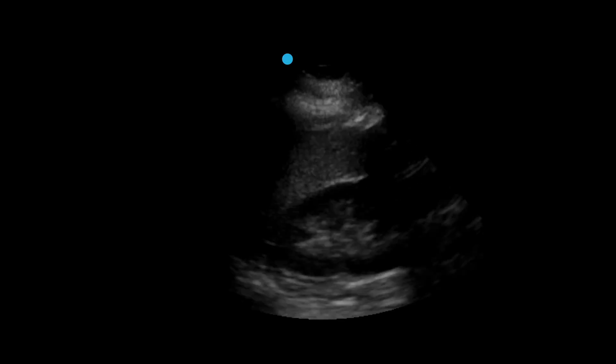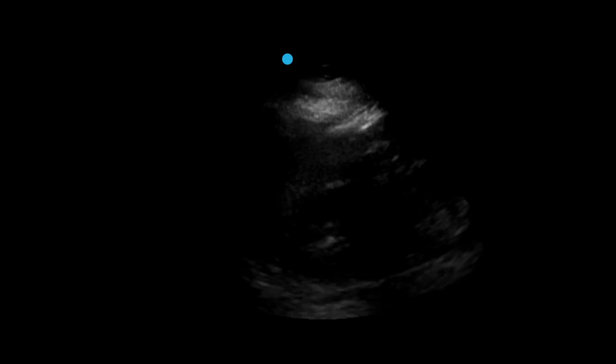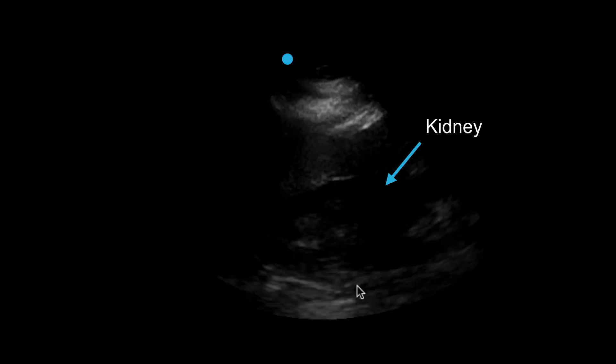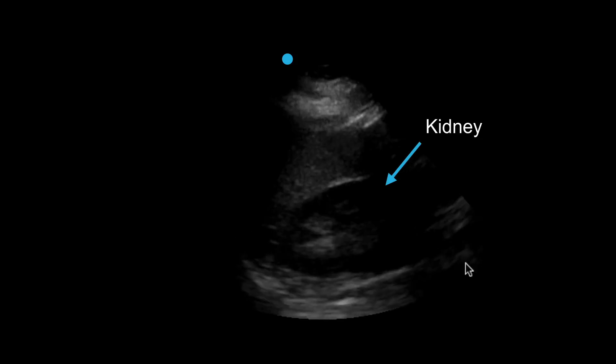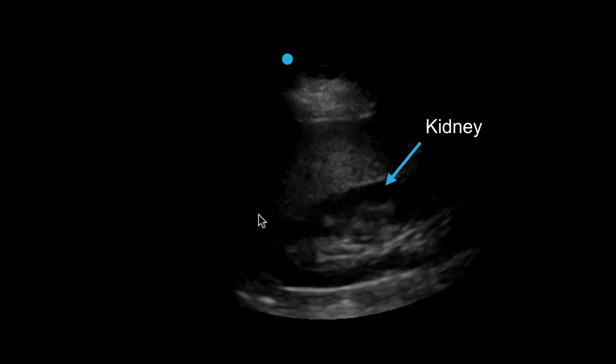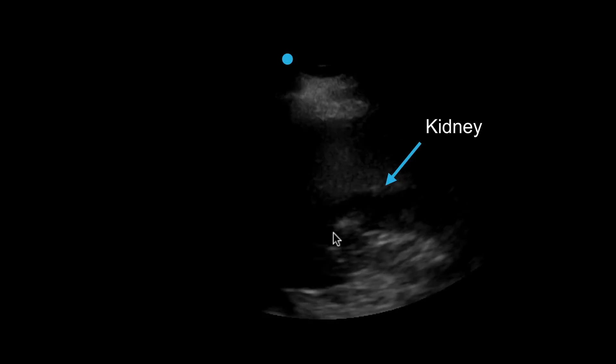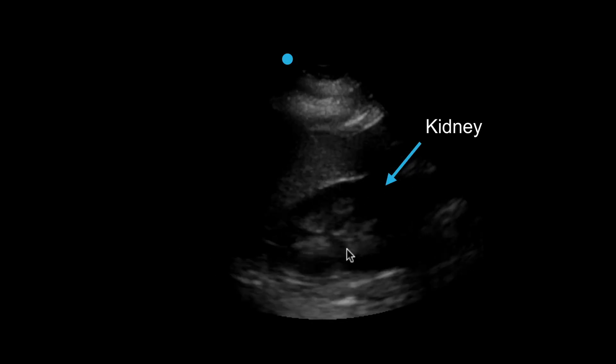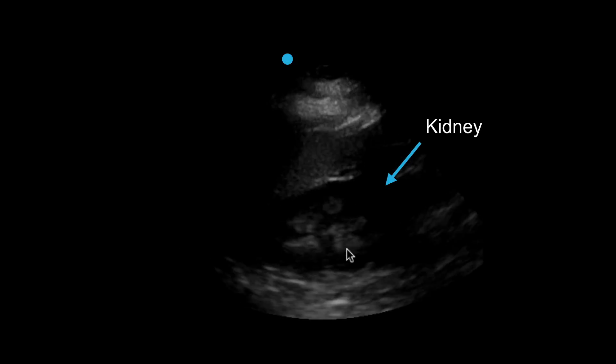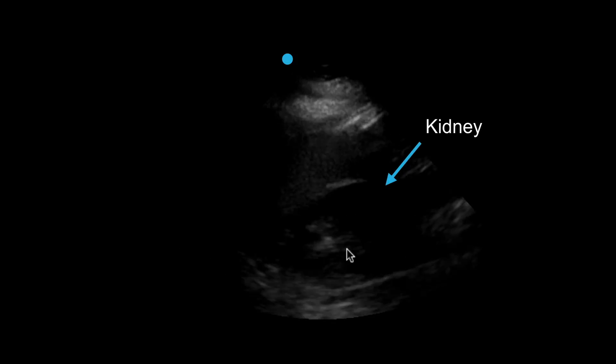This is an example of a normal kidney in longitudinal axis. Notice the long cross-section of the kidney with the center hyperechoic region representing the renal pelvis.